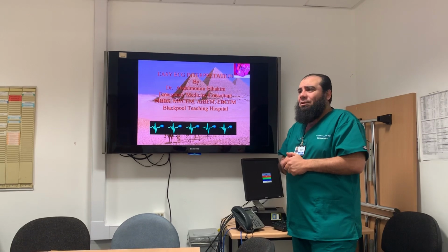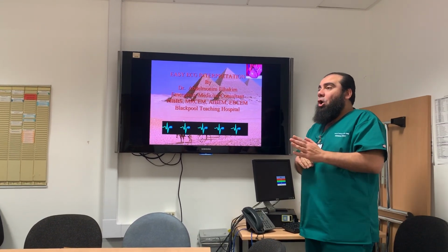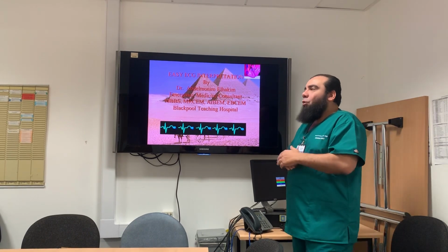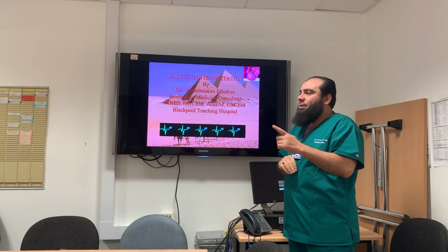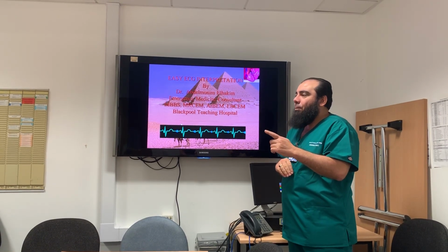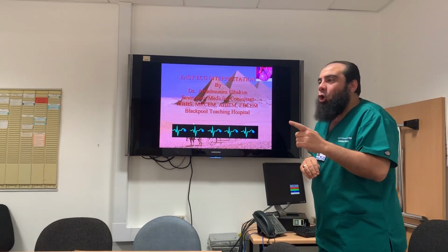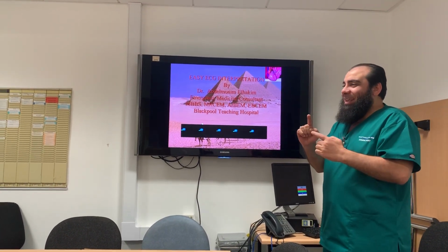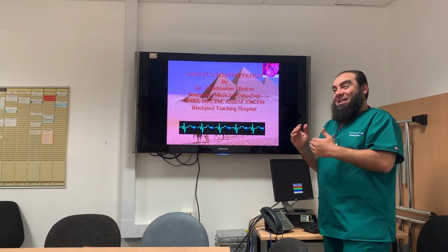Anyone knows what is ECG? A tracing of the electrical activity in your heart. So all of us know what the P wave represents. Contraction? Contraction is a mistake. That's why it's depolarization. It is again electrical activity. It does not mean the heart is working.